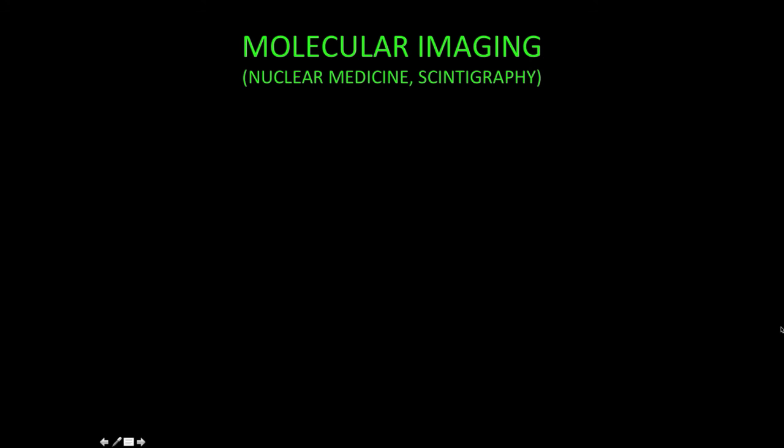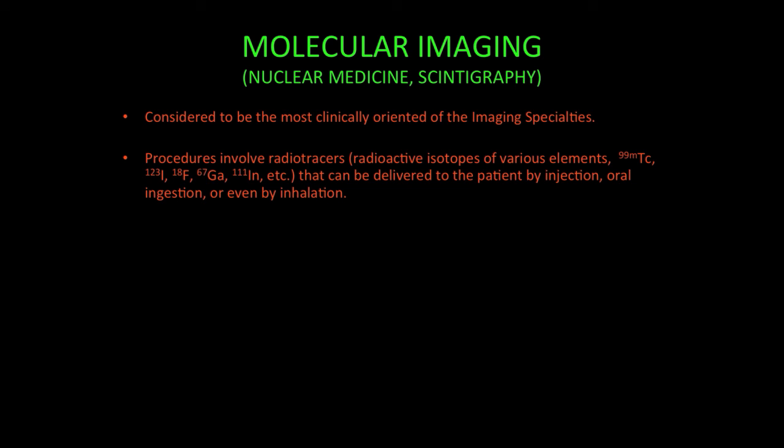Molecular imaging, better known as nuclear medicine or nuclear scintigraphy, is considered to be the most physiological and clinically oriented of the imaging specialties. Essentially, radioactive isotopes, which are called radiotracers, are injected or given orally or by inhalation, and these are delivered to the target organs.